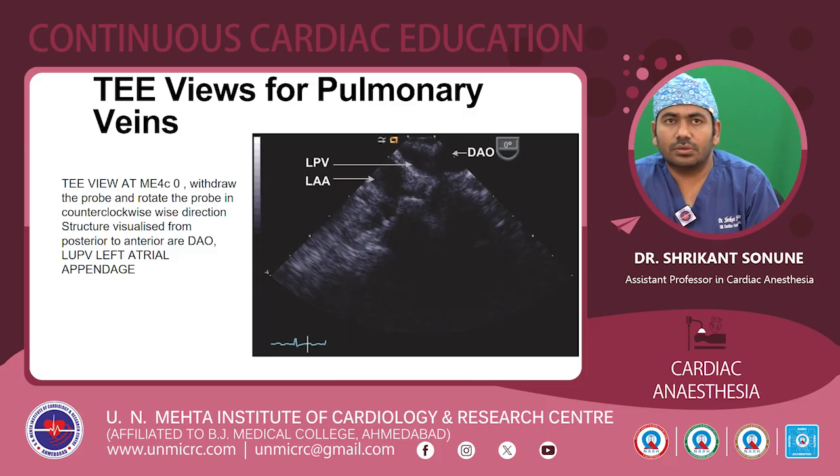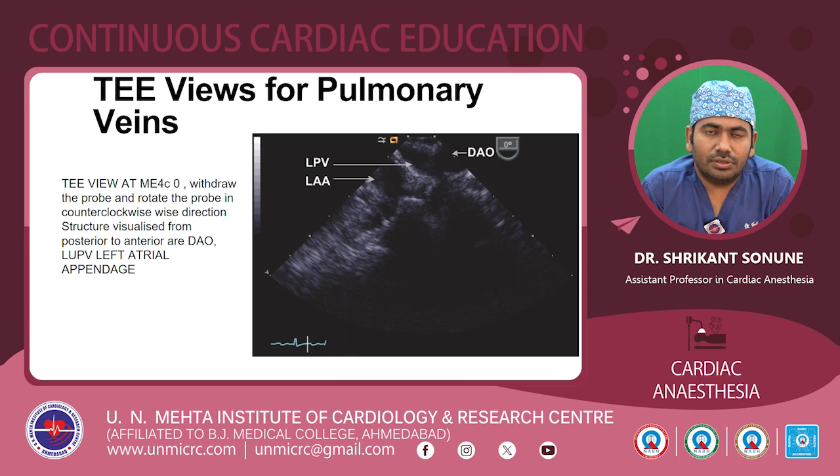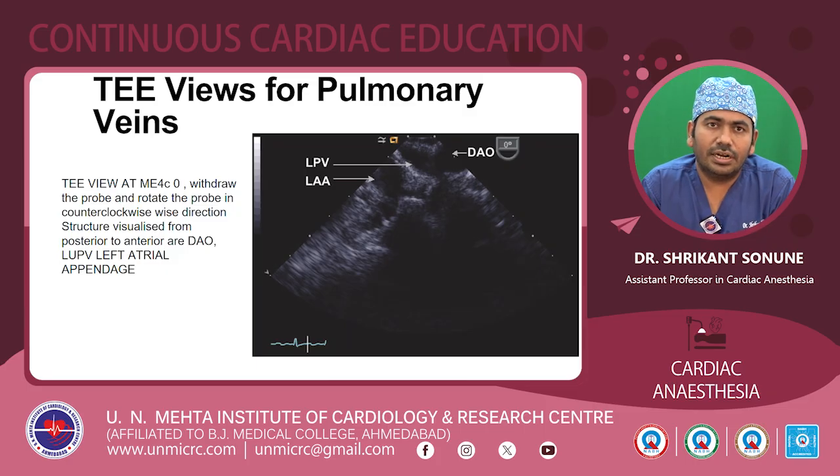Okay. So, this is the TE view for the pulmonary vein which can be achieved at a mid-esophageal 4-chamber view at 0 degrees of multiplane angle. To form this view, we have to just withdraw the probe and rotate the probe in the counterclockwise direction, and the structures visualized in this echo image from the posterior to the anterior are respectively the descending aorta, the left pulmonary vein and the left atrial appendage.